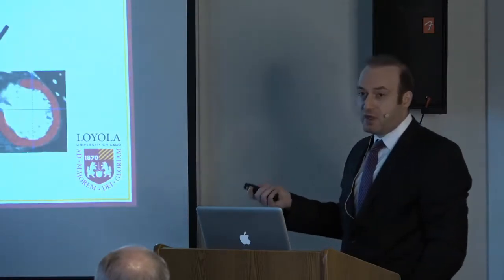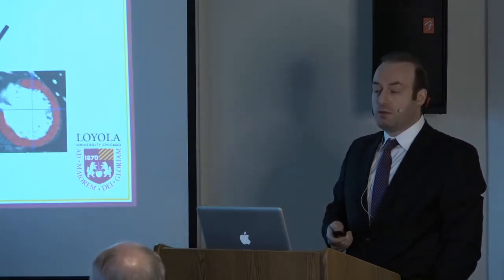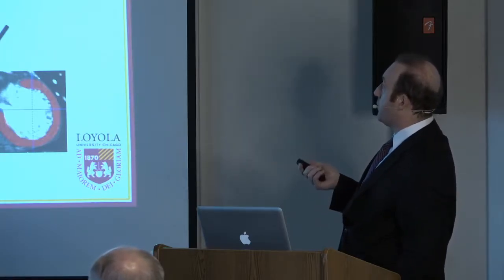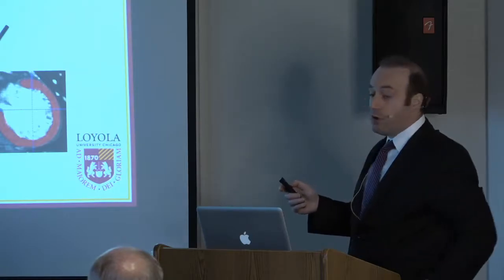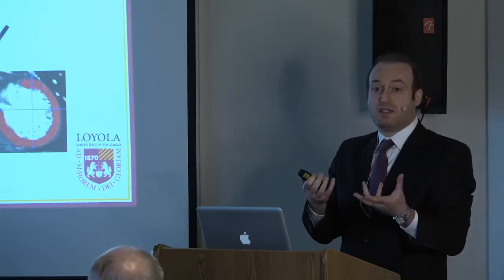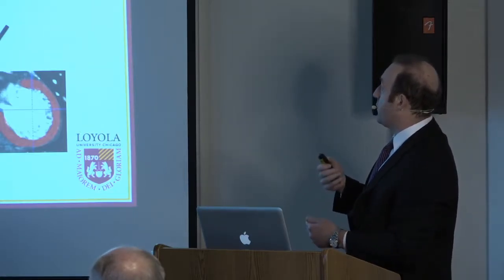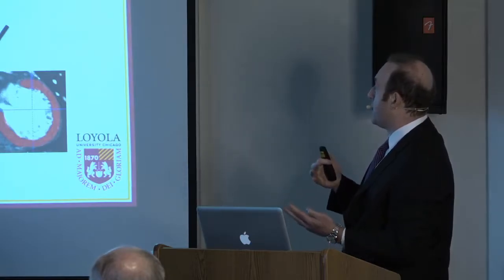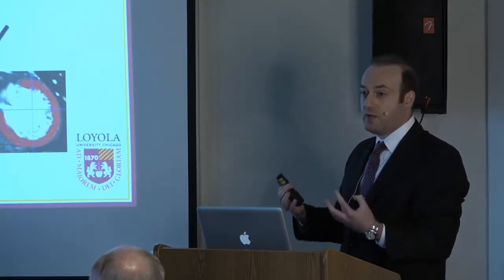Perhaps this volume to mass metric may add value and shed light into why that LAD was indeed ischemic. So we know that coronary artery flow scales with both vascular volume and the mass, and both can be derived from that CT scan. The ratio of the vascular volume to myocardial mass may provide insight into ischemia related to the inadequate coronary supply to a given myocardial tissue demand. So it's essentially a supply-demand mismatch.